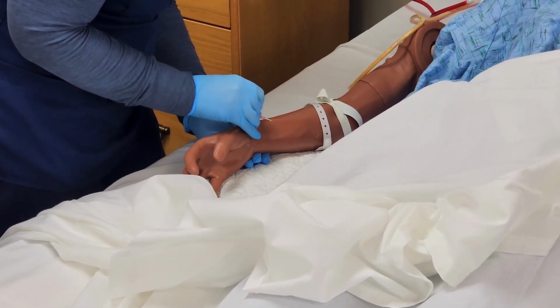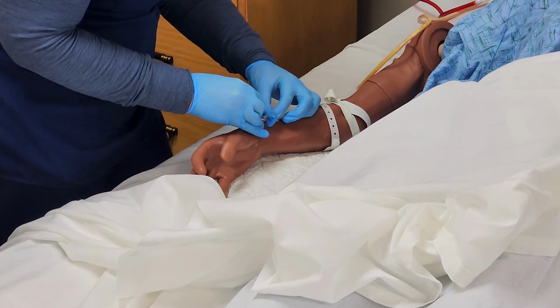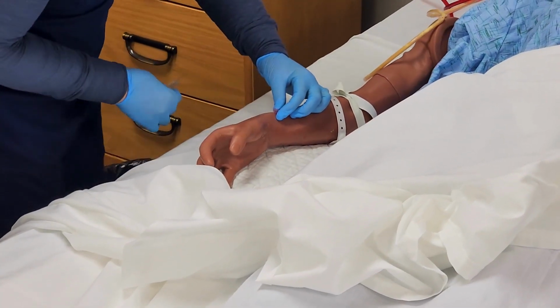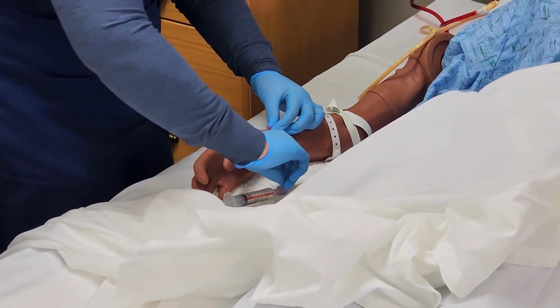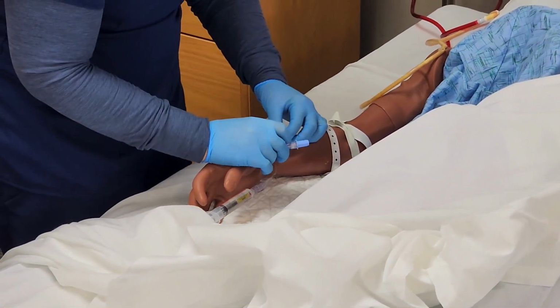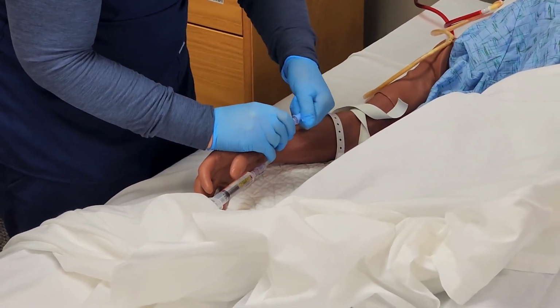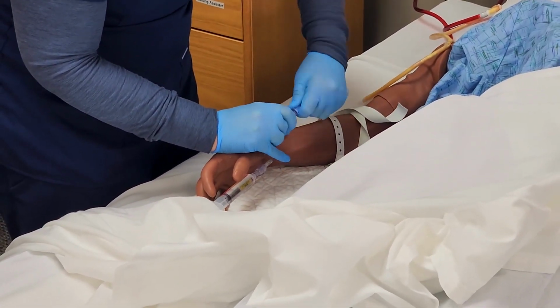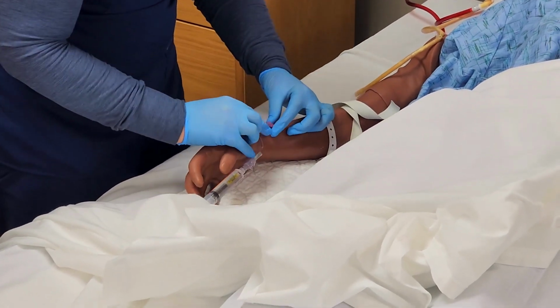Okay. And then we're going to release our safety, putting that over there. I'm going to grab my, secure your IV, release your tourniquet, and try to get the top off of there.